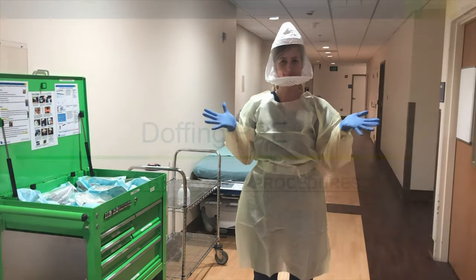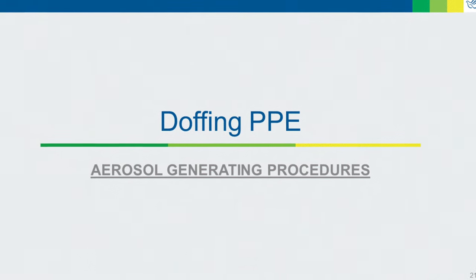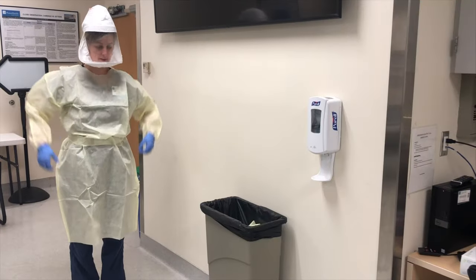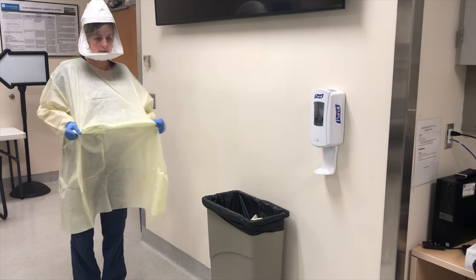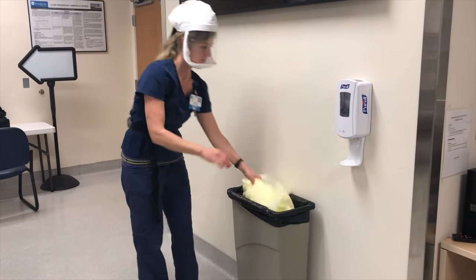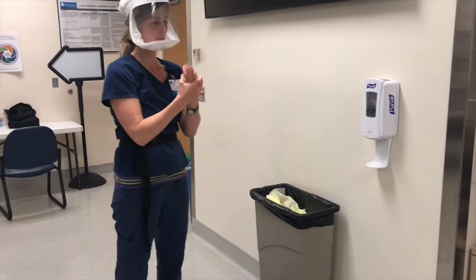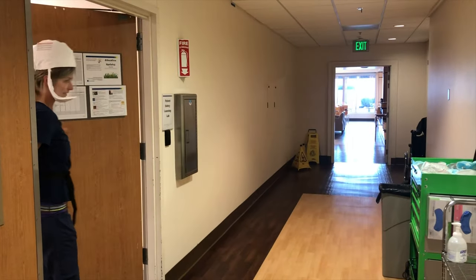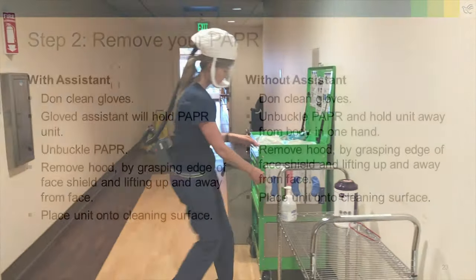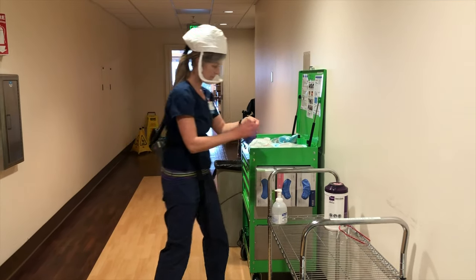You are now ready to enter the patient's room. Just like before, we will begin doffing our PPE in the patient's room. Start with removing your gown and gloves, being careful not to touch the contaminated portions. Perform hand hygiene and immediately exit the room. Before removing the PAPR, you will need to don clean gloves. It is helpful to have an assistant.